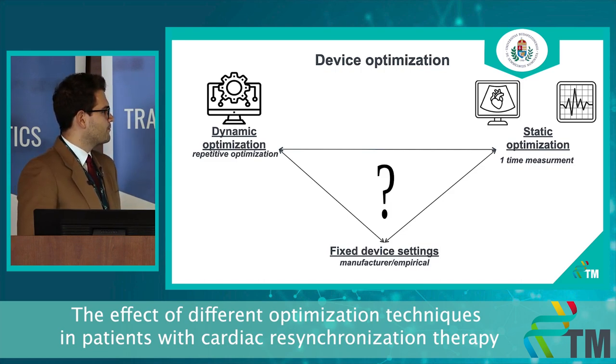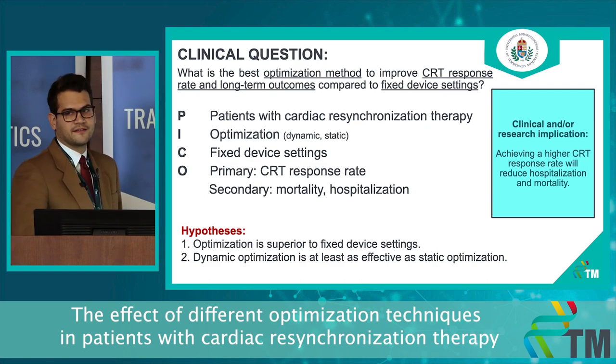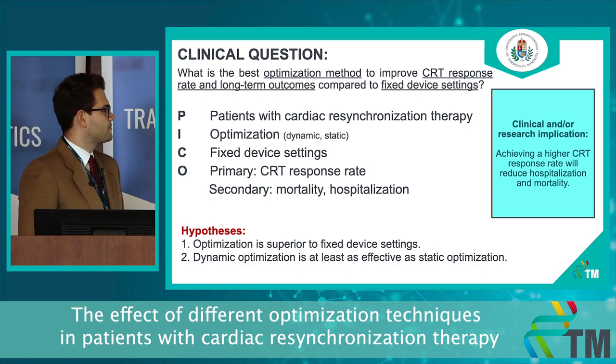But we don't know what the relationship is between static optimization and dynamic optimization, and we also don't know if there is any difference between these optimization techniques and fixed device settings programmed empirically by the implanters. Our aim is to find the best optimization method to improve CRT response rate and long-term outcomes in patients with cardiac resynchronization therapy.